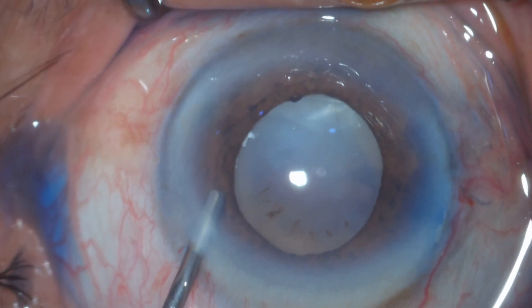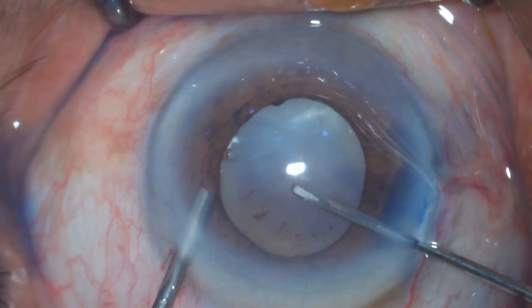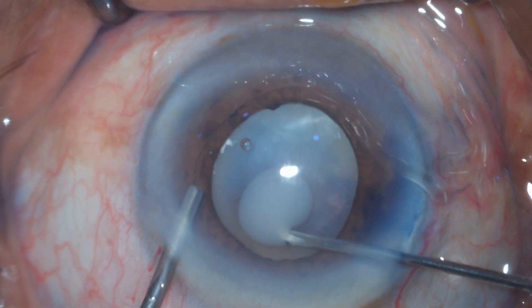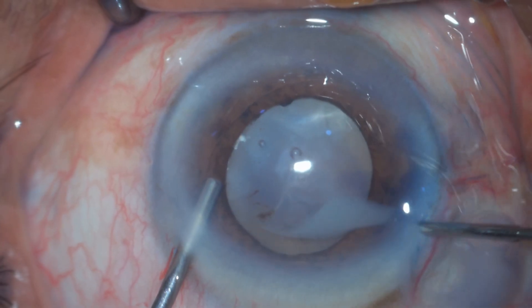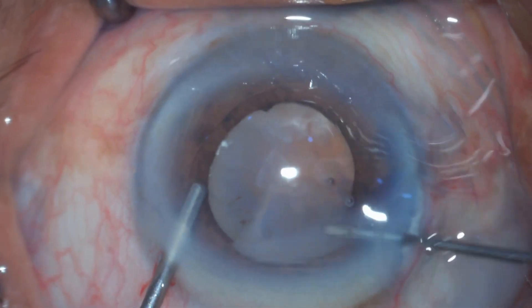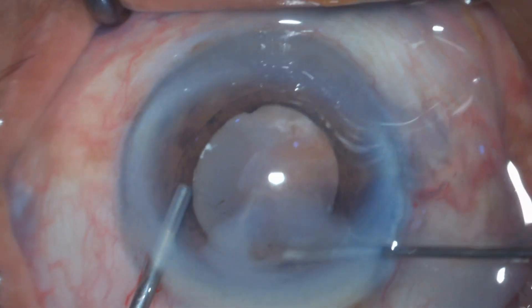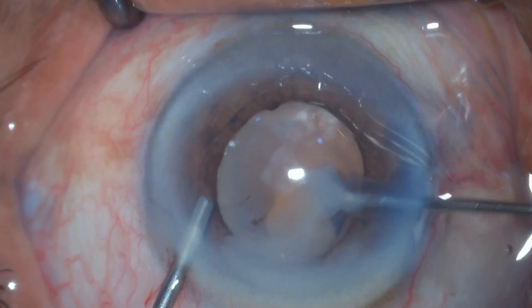The surgery is under topical anesthesia, and after getting the main incision and side port done, I am trying capsulorhexis. This is my preferred technique, which I call pressure capsulorhexis. I am using a 26-gauge cannula attached with 2cc visco-dispersive viscoelastic.